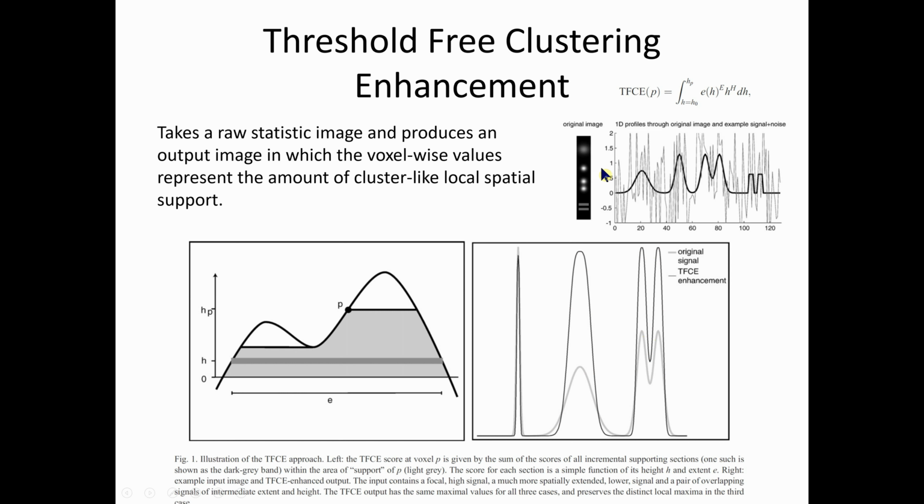Similarly, here, you get enhanced data when you have more supporting information. So through that, you can get a more complex signal, like up here above, and you can work out what actually looks like supportable p-values. The adjacent areas are supporting that value. So what it turns out to be is, here's the equation of how they're building it, but your height is dependent upon the width of your data at various cut points, so that you can have your data reflect how much supportive or the total mass of your data.